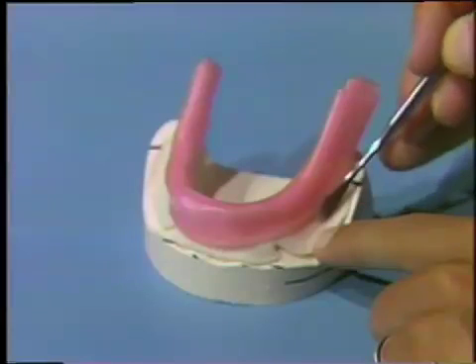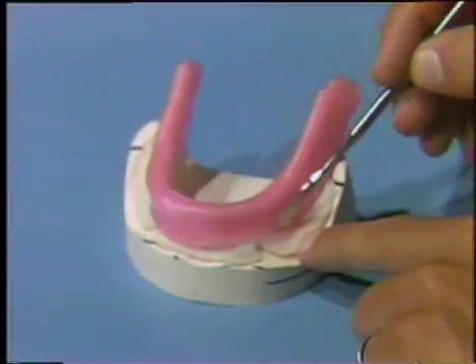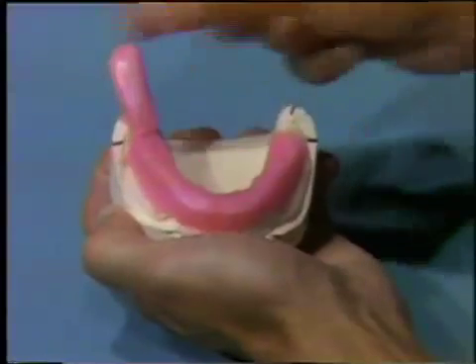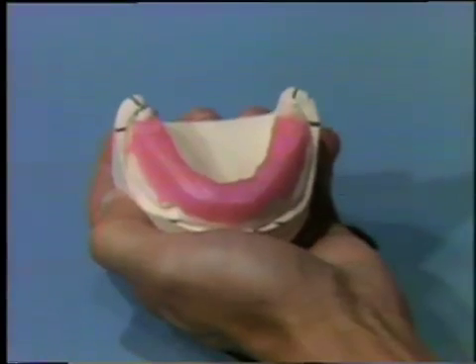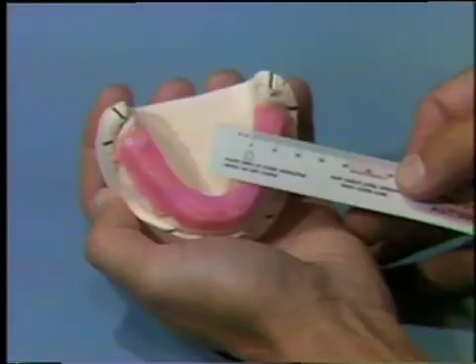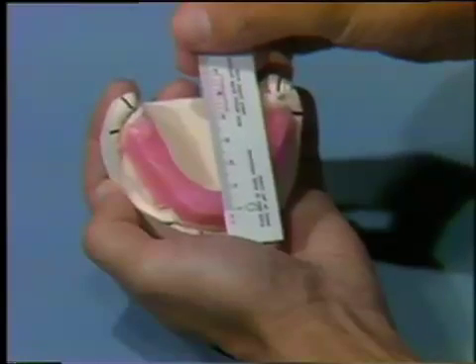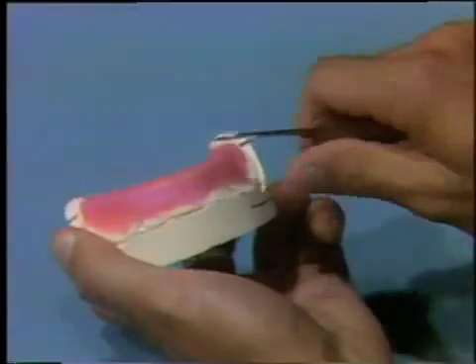Seal the wax rim to the impression tray with a hot end of a number seven spatula. Using a laboratory knife, modify the shape of the rim according to these criteria: the width in the posterior region is 10 millimeters, the width in the anterior region is 7 to 10 millimeters, and the occlusal surface is flat.